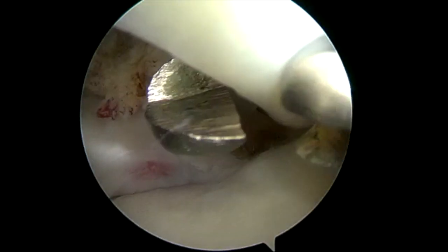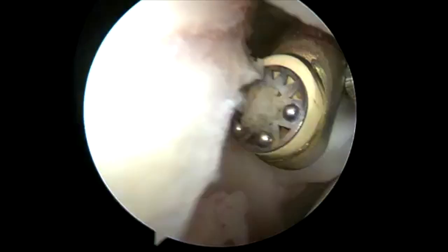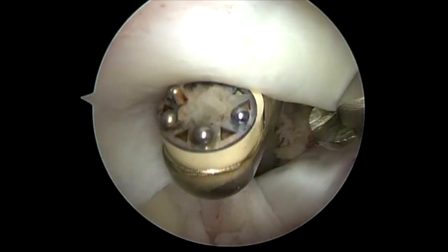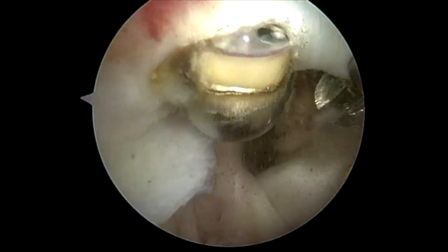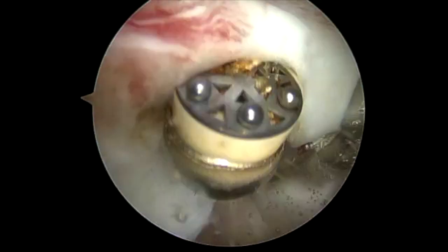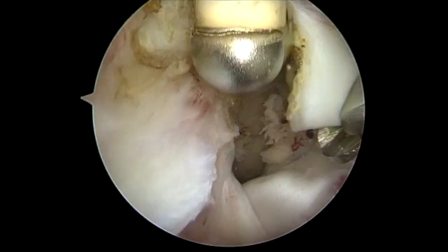I bring a Kocher in and grasp the biceps. This is also marking my fixation point so I know where the anatomic tension is. I release and tenotomize the bicep, then retrieve it percutaneously out of the anterosuperolateral portal.